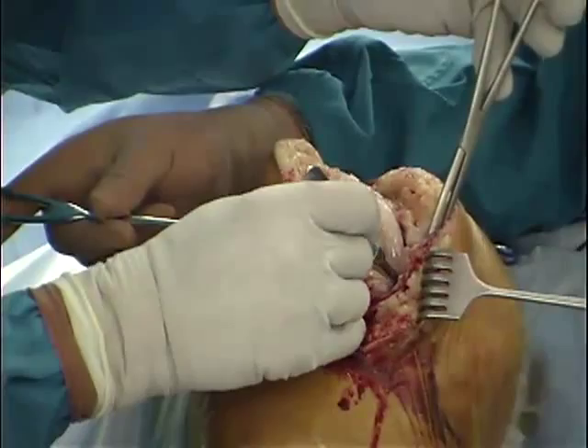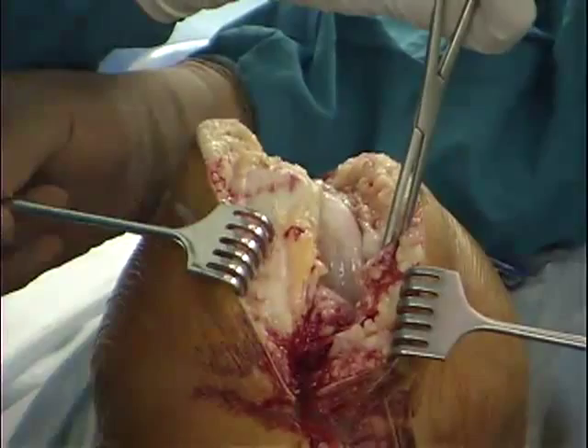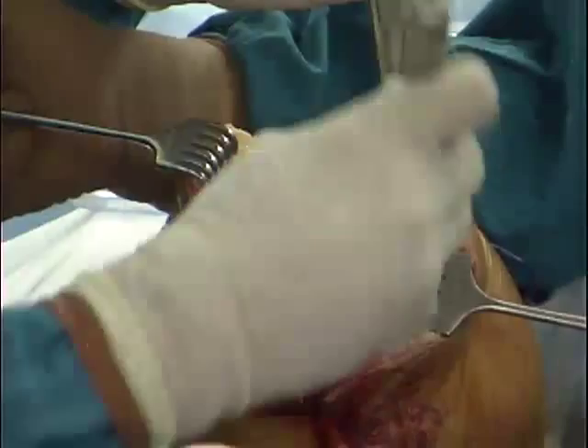In this case, the dissection is carried approximately two centimeters below the level of the joint line to correct this patient's deformity. To complete the posterior portion of this release, an osteotome is driven gently in the same interval back to the posterior medial corner of the knee.